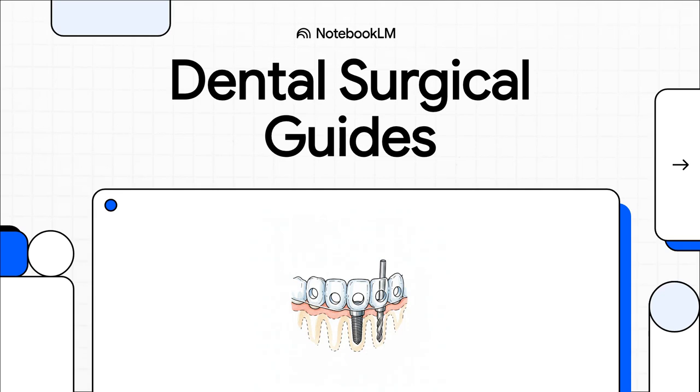Welcome back, focused learners. Today, on The Explainer, we're diving into something absolutely crucial in modern dentistry, the types of surgical guides for dental implants. Our goal today is pretty straightforward, but honestly, it's a real game changer.